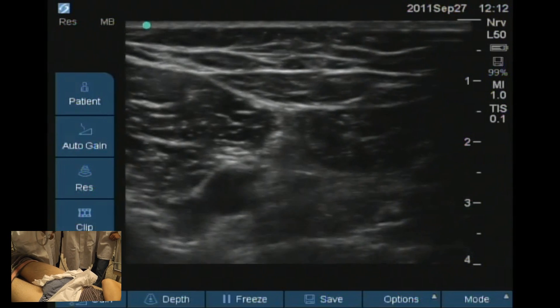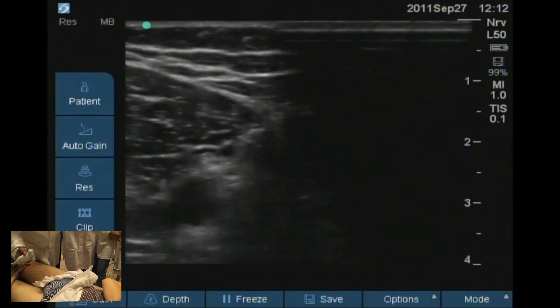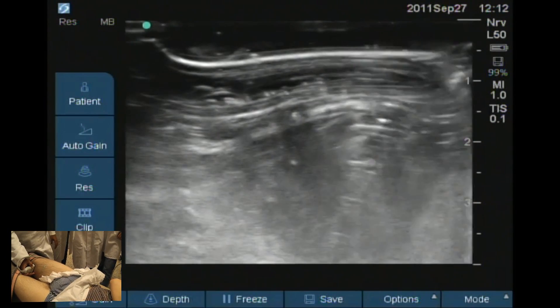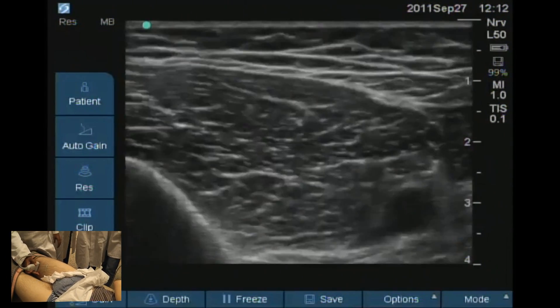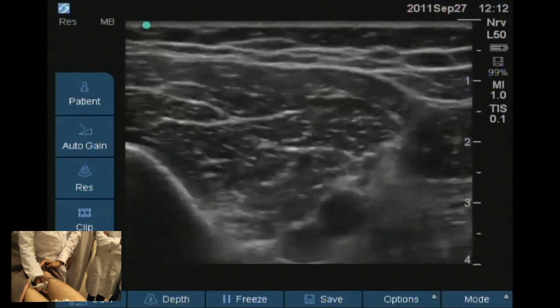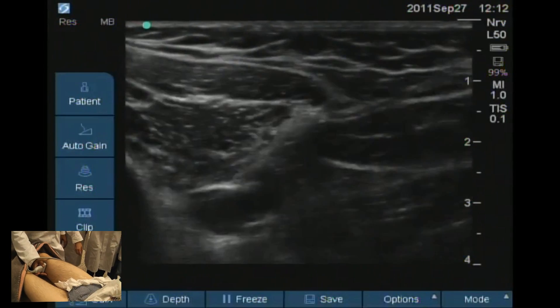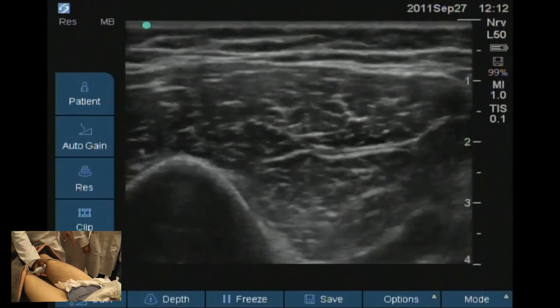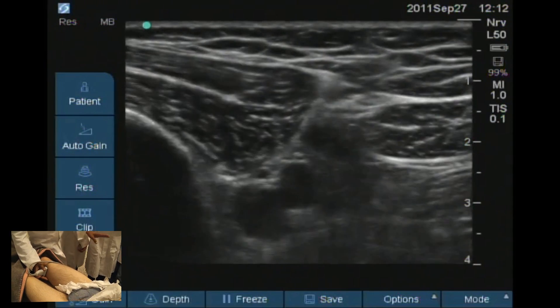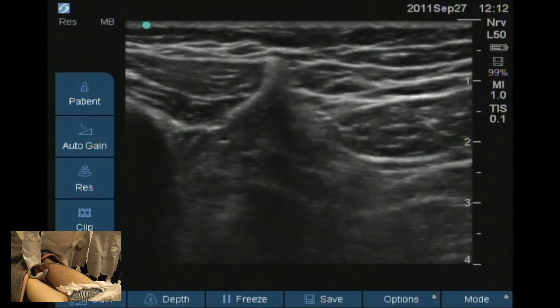We come to the point where the femoral artery is going to exit through the adductor hiatus to become the popliteal artery. The nerve is still in a straight position at this point. Then the femoral artery leaves — it just disappears.